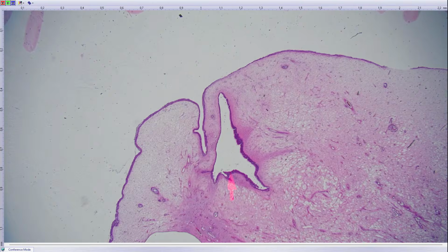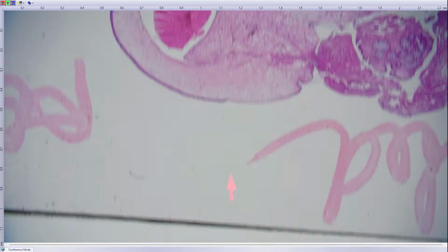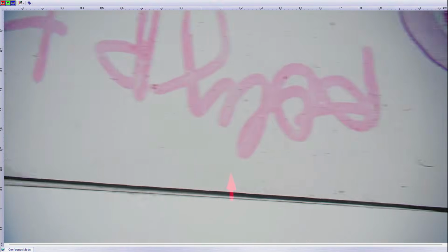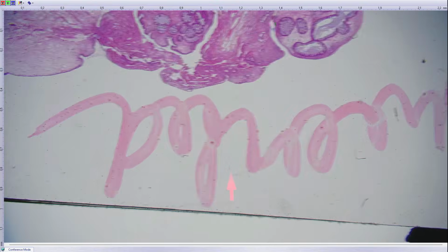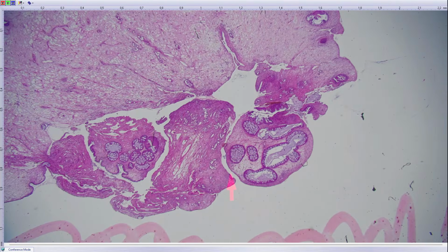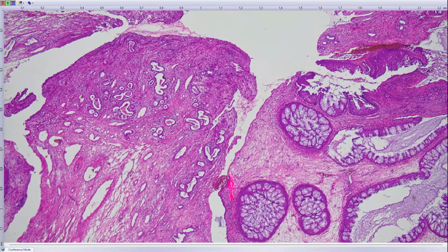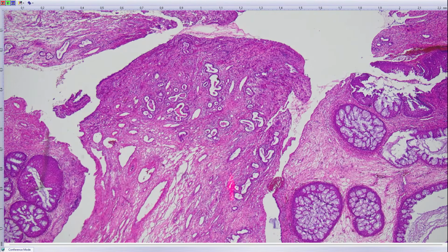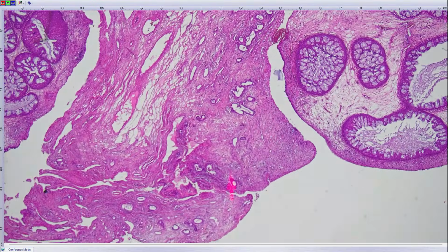We had a visitor here during the last week, and he was from the United States, used not to use the holder for the slide, so that the holder is here very badly taken. But the lesion was having, you can see here, the seromucinous hamartoma with atypical glandular structures.